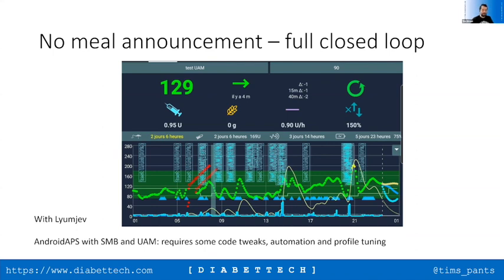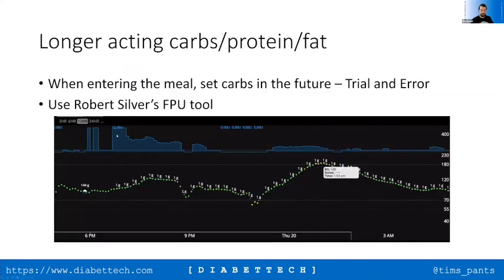Now, there was a mention earlier about e-carbs and dealing with them and how the platform works in relation to all of these things. So effectively longer acting carbs, low GI foods, what happens with protein and fat, all of these things. And actually, just a comment that Achim's made about Lyumjev, with your glucose level getting stuck in the 180s. And yep, I completely agree with that statement, Achim. I've had exactly the same experience where it goes up and gets stuck. It's entirely frustrating when it happens.